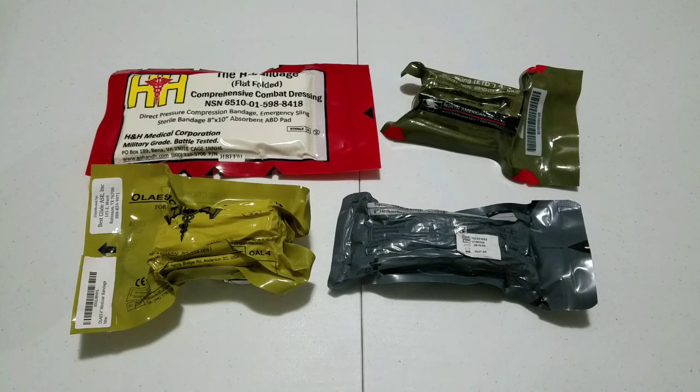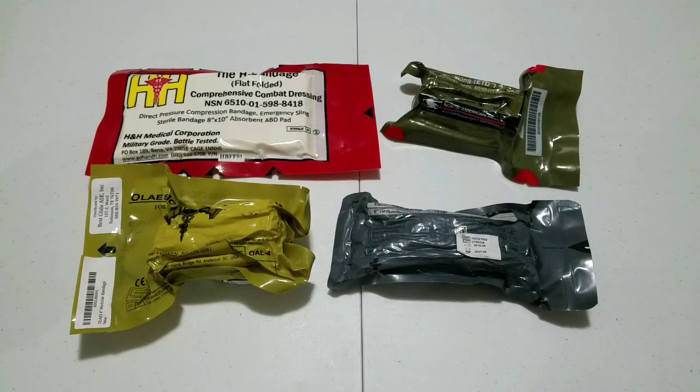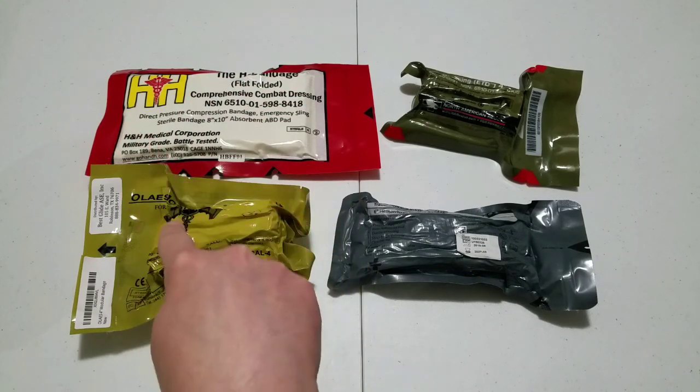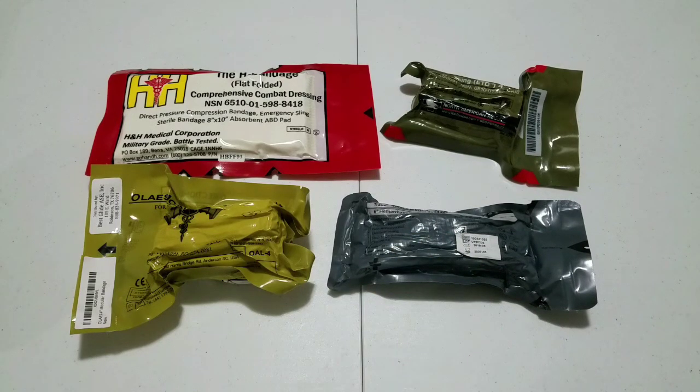Hey YouTube, Vinnie M here and welcome to another video on the channel. Today we are doing an informational video about a pressure dressing. There are a total of 4 videos in this series, one for each of the 4 dressings in front of you: the North American Rescue ETD, the H&H Medical H Bandage, the Tech Med Solutions OLAES Bandage, and the Percy's Medical Israeli. Be sure to check out each individual video to find out information specific to that pressure dressing and its pros and cons.